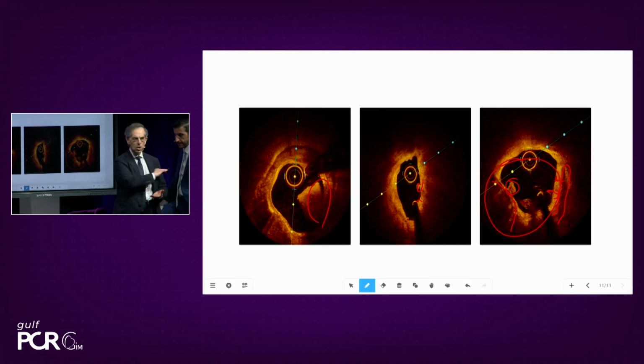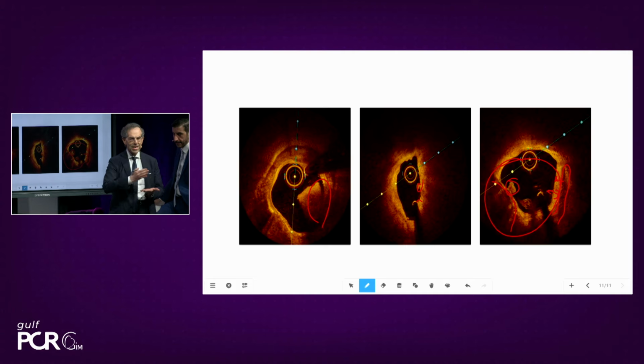And yesterday we saw a lot of thrombus located inside. So this is one of the most important points. You need to react to this situation. You cannot leave a thrombus forming. You check the ACT first. If, like yesterday, you still have a thrombus, you need to use IIb/IIIa receptor inhibitors, small molecules, and then check after a few minutes. Patients are not the same. Some patients are very procoagulant, and you have one of the best tools in the world for detecting thrombus forming online.